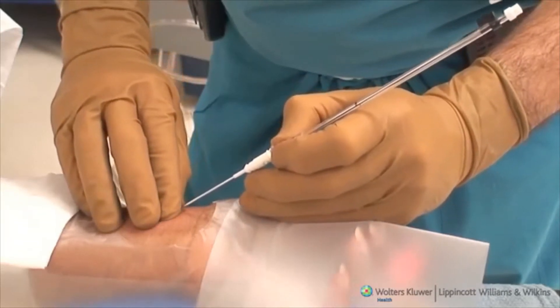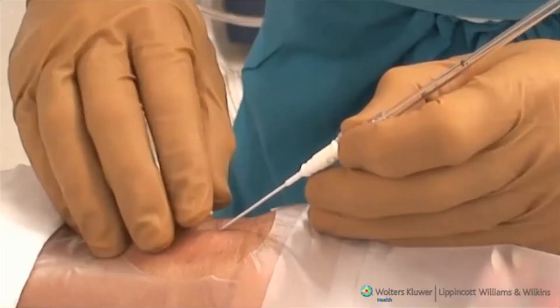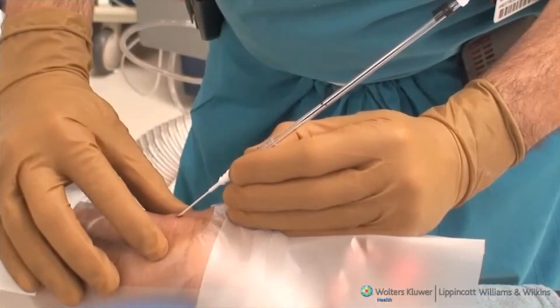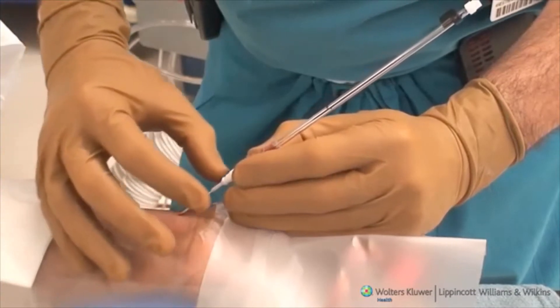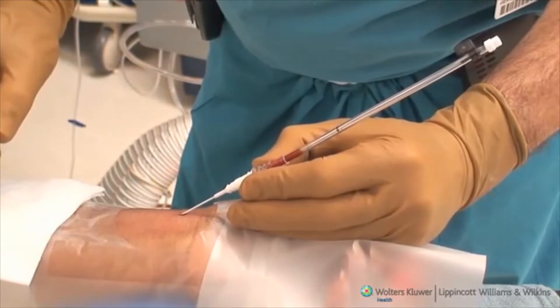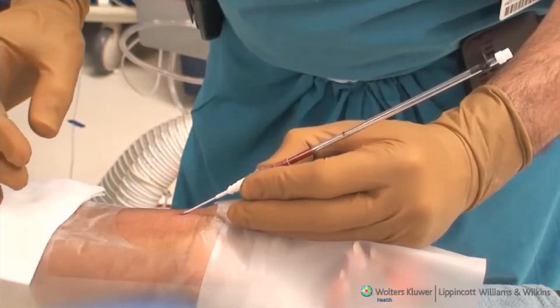After palpating the radial pulse, the skin is punctured over the artery using the catheter and needle at an angle of 45 degrees from the skin. The needle and catheter are advanced until spontaneous pulsatile bright red blood enters the plastic hub of the needle and column. This initial flash is obtained when the needle tip has entered the vessel lumen.